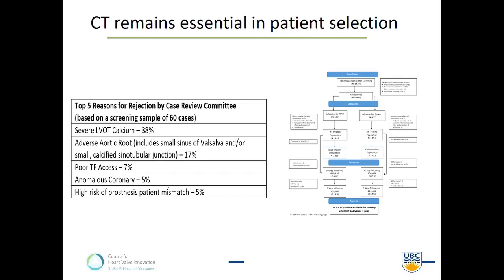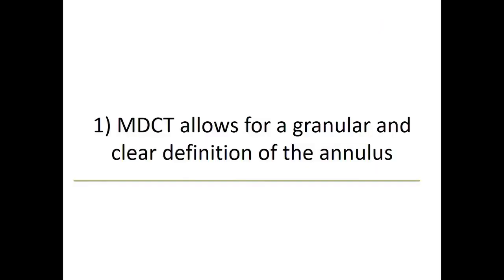And so what I firmly believe is that the surgical risk score is almost entirely irrelevant to the determination of whether or not a patient should undergo SAVR or TAVR. What is really key is going to be the patient-specific risk defined by anatomy from CT. The CT will define, as we heard from Ron, based on root geometry, subannular calcium, coronary occlusion risk, and whether the aorta is dilated. All of these factors are going to be determined by CT, at which point the patient will be treated either surgically or, in the overwhelming majority of cases, with TAVR.